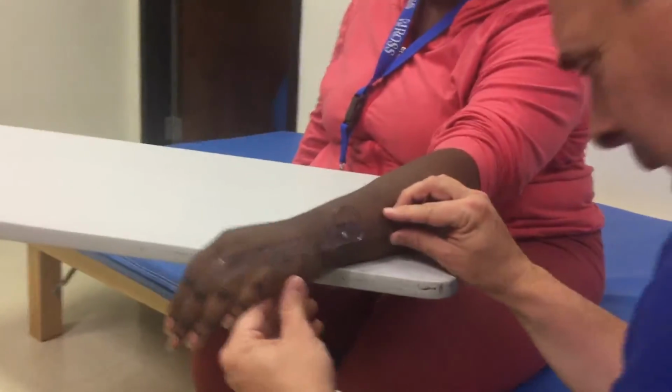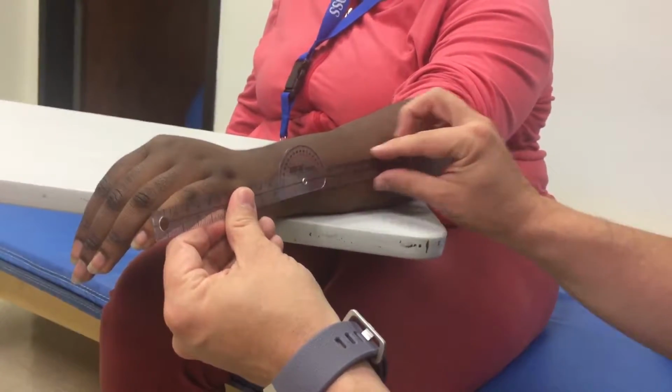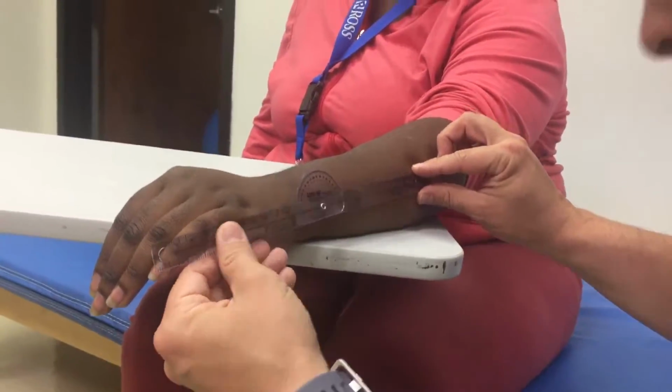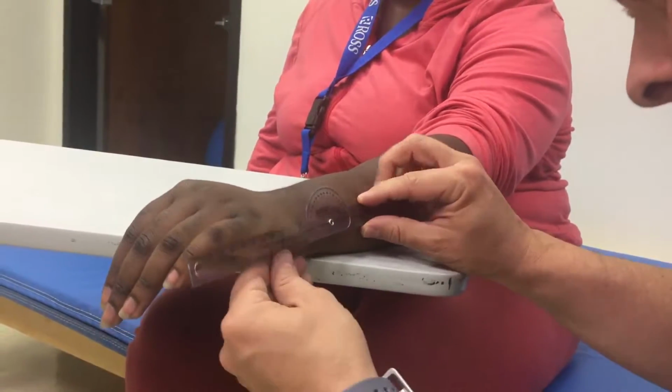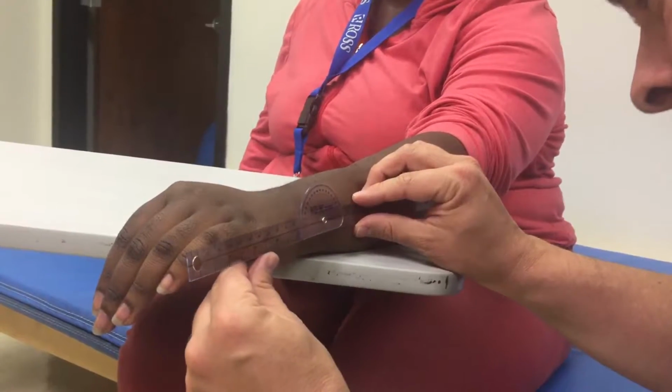So then the next one is extension, and extension is going to be the same way. The axis of rotation is going to be just distal to the ulnar styloid process, which is there. The stable arm is going to be lined up with the middle of the forearm. The movable arm, the black line, is going to be lined up with her fifth metacarpal.